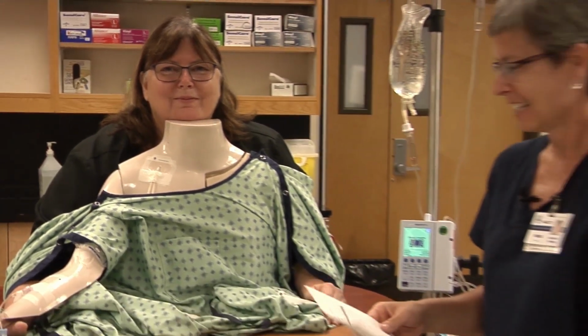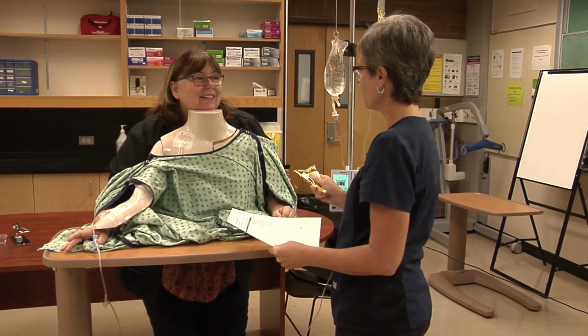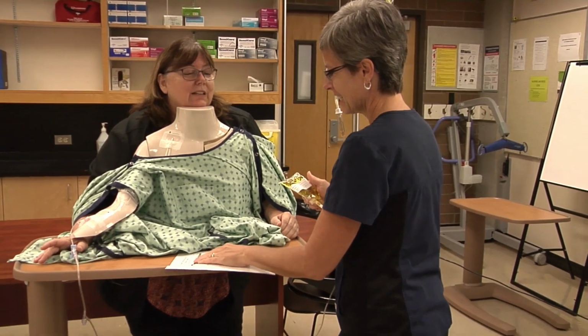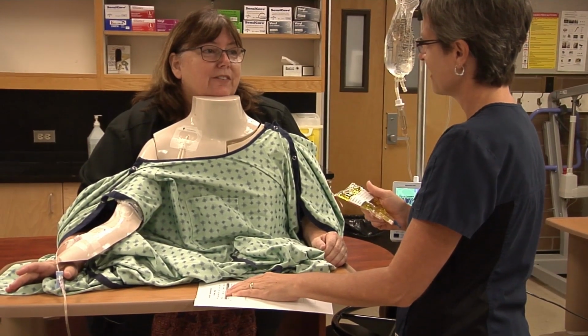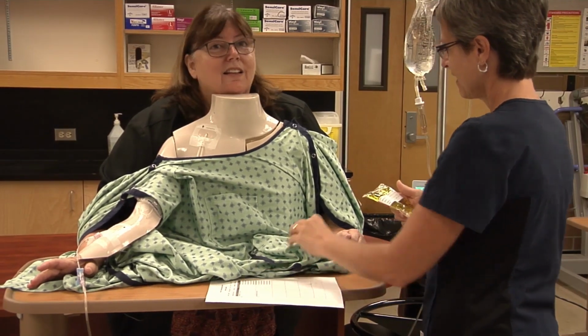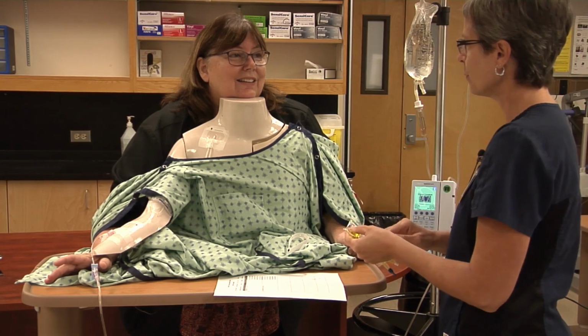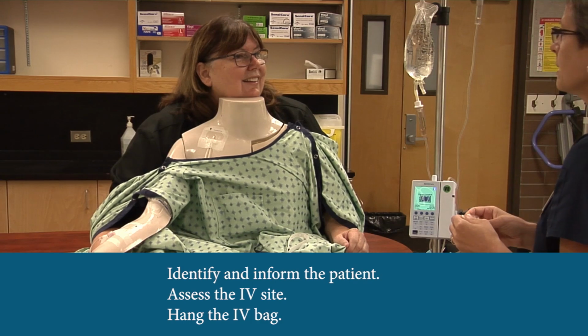Hi, Wendy. Renee, how are you? I'm well. So we have your IV med ready. Can you tell me your name and your birth date? My name is Charlie Smith, and my birthday is February 15th, 1972. Thank you very much. So I have your antibiotic for you. You've had it before. All right, so I'll just explain to you what I'm going to do as I'm doing this.